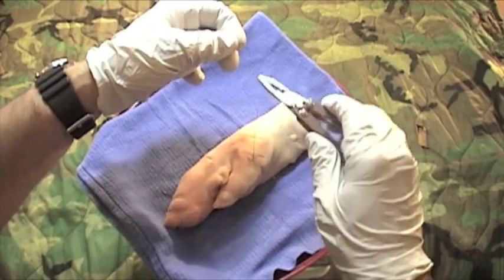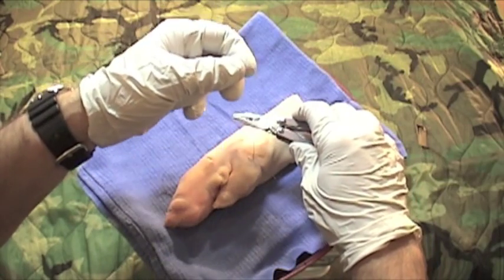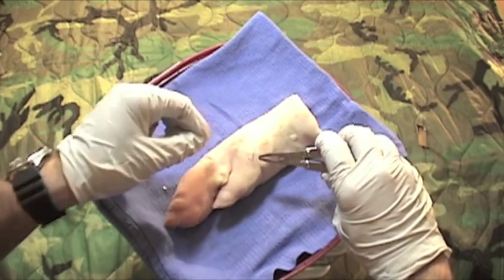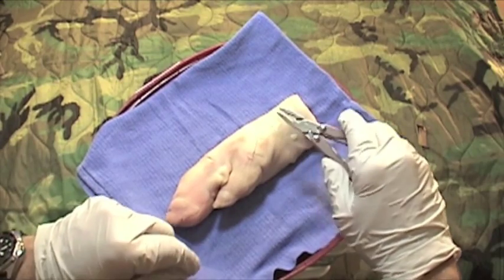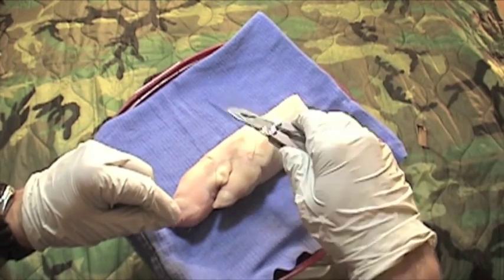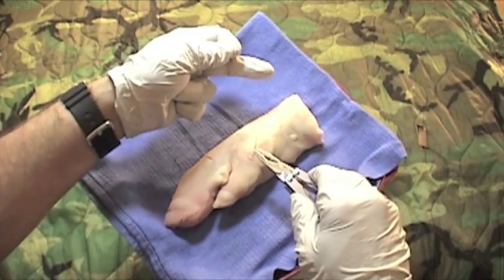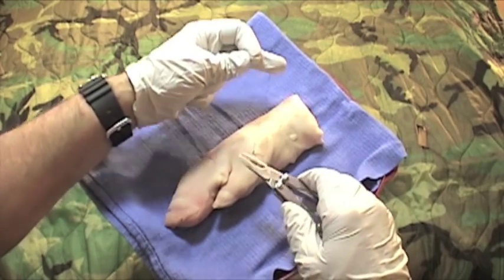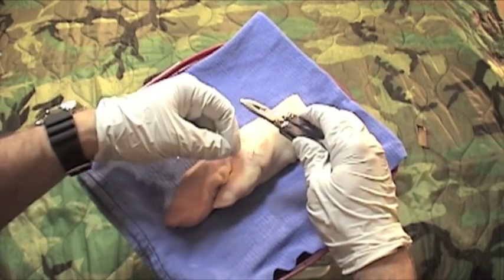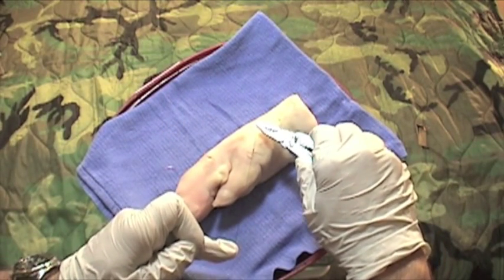I still have the V — I've got the long arm and the short arm. I'm going to put the needle driver in the V, wrap over towards the short, this time one loop, and grab the short and pull. I'm going to keep doing that for a total of four knots. Short arm, long arm, in the middle of the V — over one. Grab the short arm, pull tight. Long arm, short arm, in the middle of the V — wrap long over to short, one throw. Open and grab the short, pull that knot tight.